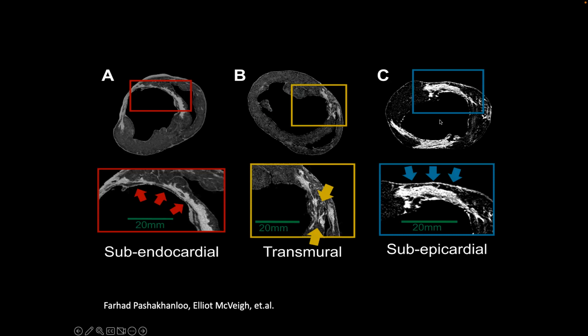We did this in a bunch of infarcts, right? And look at all of the details. So these are all hearts in jars. You can't do this in a living heart. And this comes back to your original question, which was like, what is the precision of triggering when you're triggering off an EKG? And what's the precision of imaging, basically? When you're trying to trigger off an ECG, you're trying to make the patient hold their breath, and the heart should be coming back to the same place every beat.